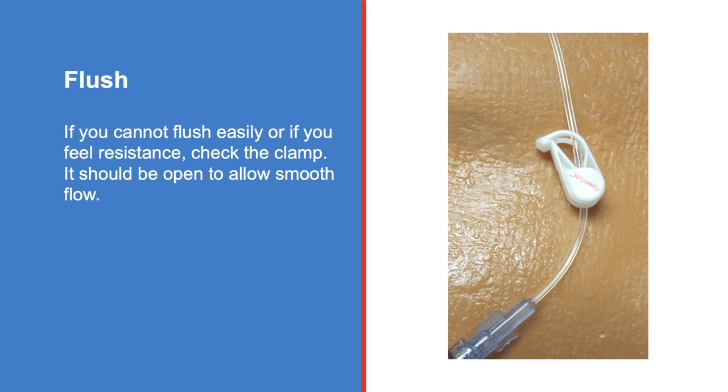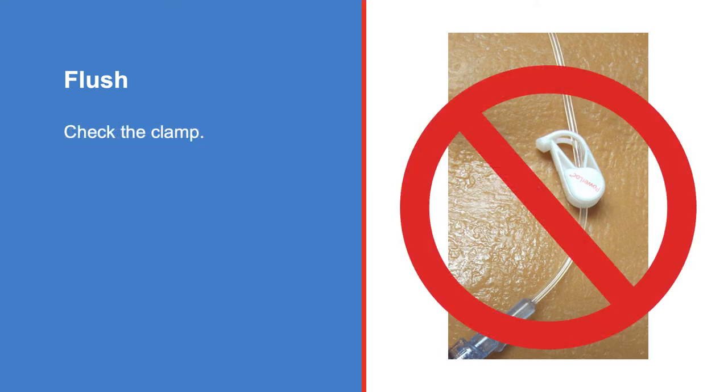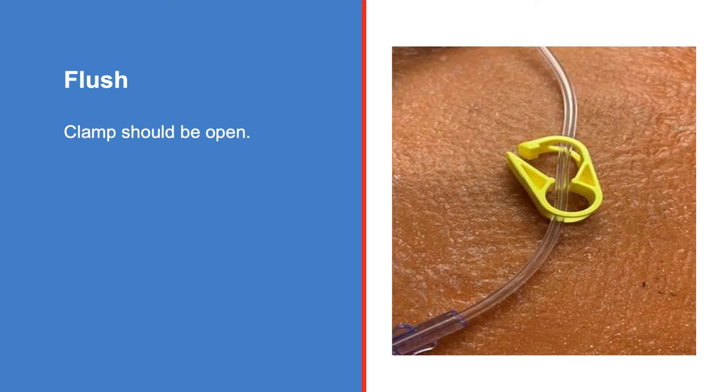If you cannot flush easily or if you feel resistance, check the clamp. It should be open to allow smooth flow. This is what the clamp looks like when it is closed. This is what the clamp looks like when it is open.